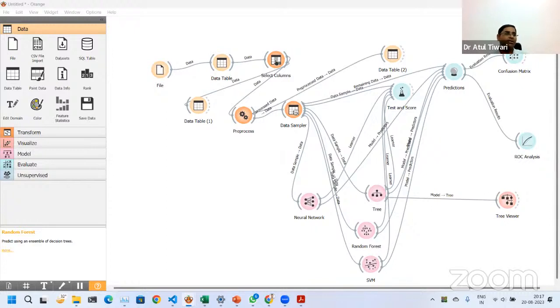For example, AIIMS might have good quality H&E stain, but in other colleges, it might not be of that brand or that good quality. So generalization would be there. That's how we can create a generalized model. The data set which I am providing is very curated. On the net, you will find free data sets from the US. Their slide images are very good quality. So if a model is created for those slides, and our slides are not that good in staining, if some hematoxylin is more, that model will perform badly. But if we create a model on our slides, that would be the best thing.